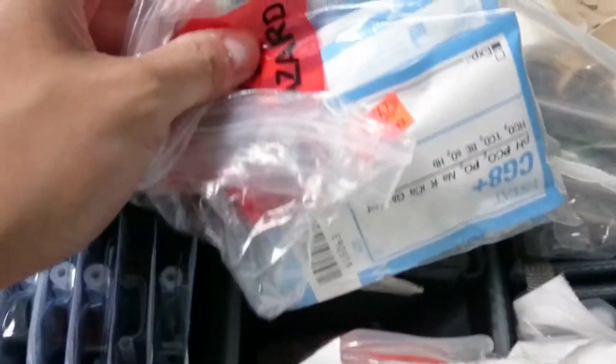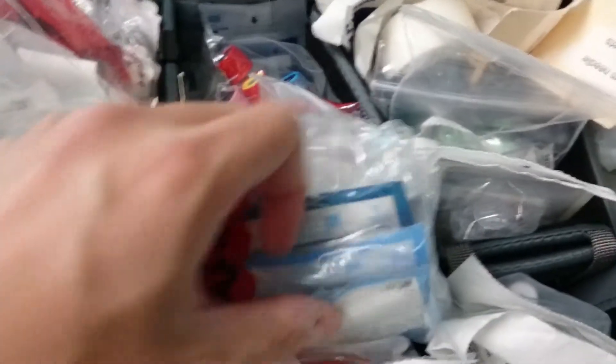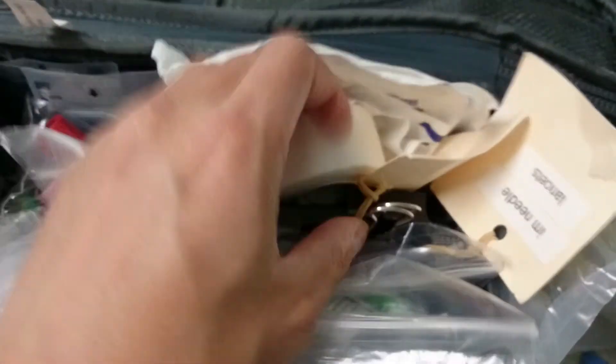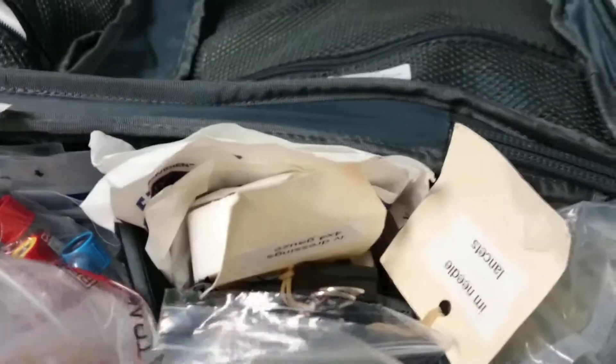I also have the ABG cartridges and ABG needles in here. Try to keep two of each — two CG8s, two CG4s. Doctors will usually like to use the CG8 first. The sharps container is useful. 4x4s up here and silk tape, because for intubation you always want to have silk tape.